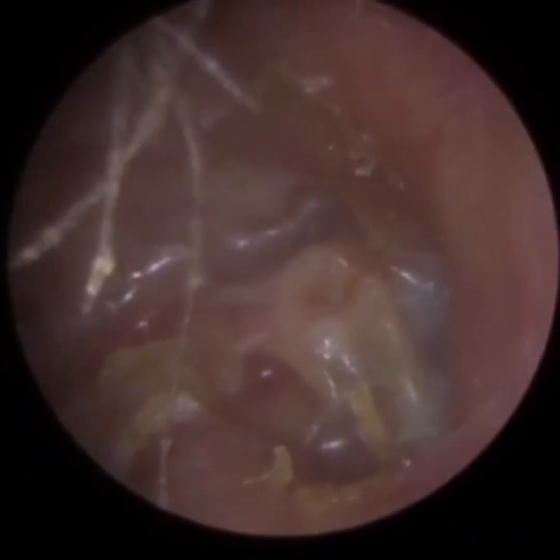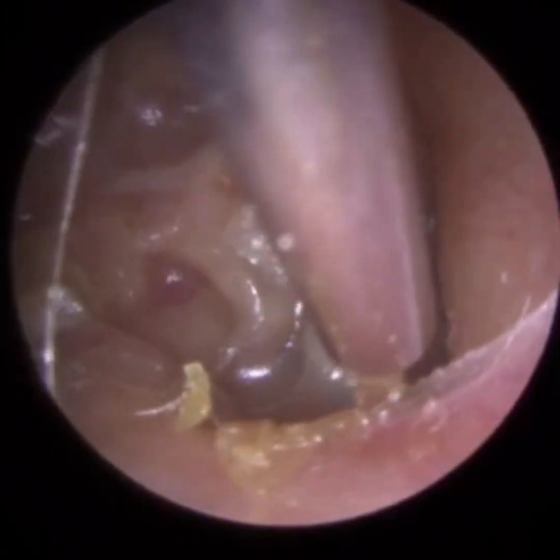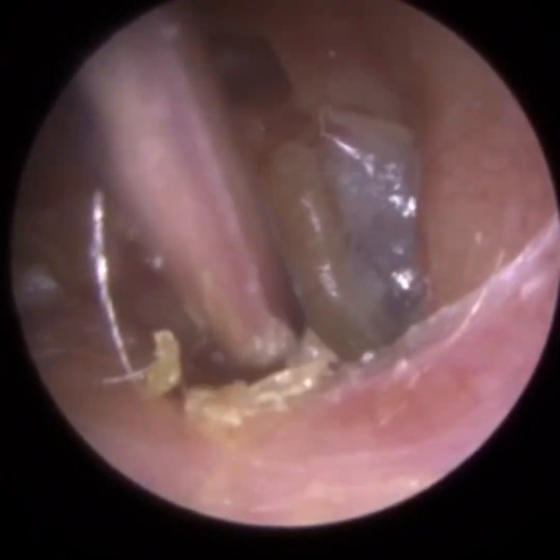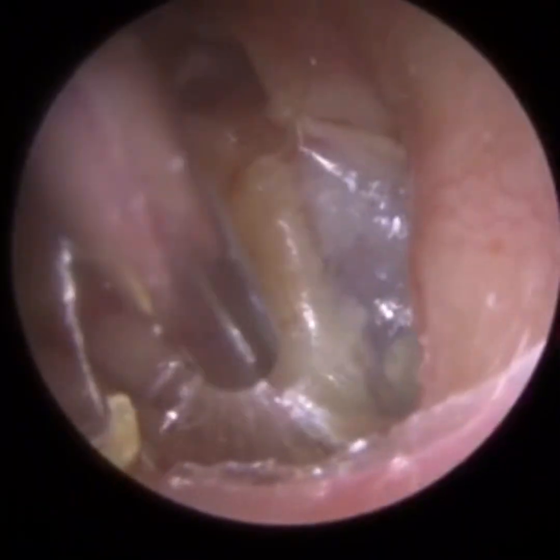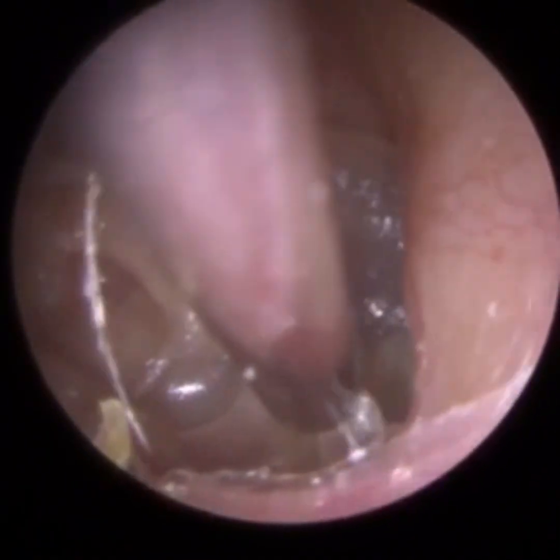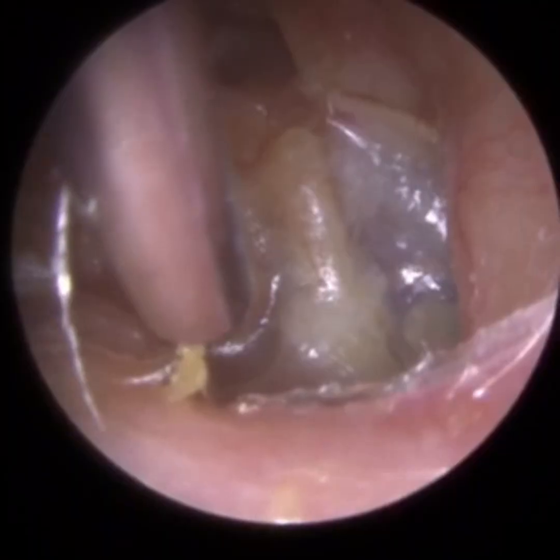I've got a feeling my narration is going to roll over, so I'm just going to go back to the ear in a moment and I'll explain the mastoid. So in front of us now, that's the eardrum. You can just see the hammer bone in the middle. Obviously, there's a lot of surgery, so it's not your normal appearance. You can see all I'm doing is moving skin, and I'll come back to why we're doing that, why it's important, in a moment.